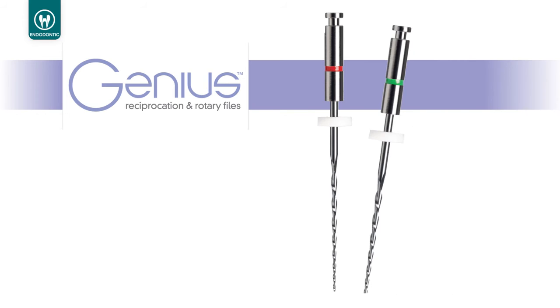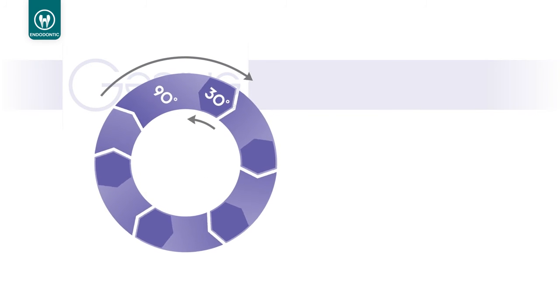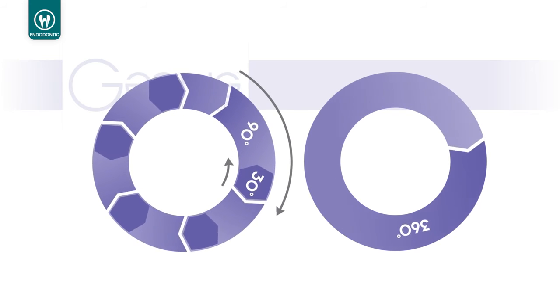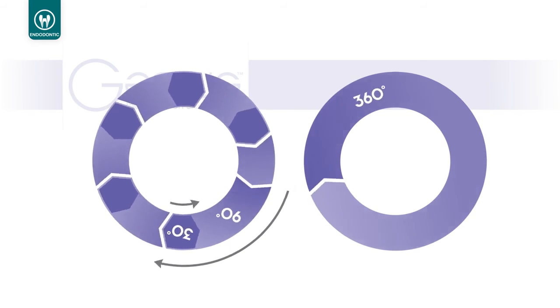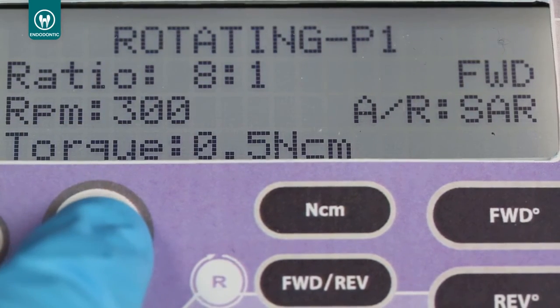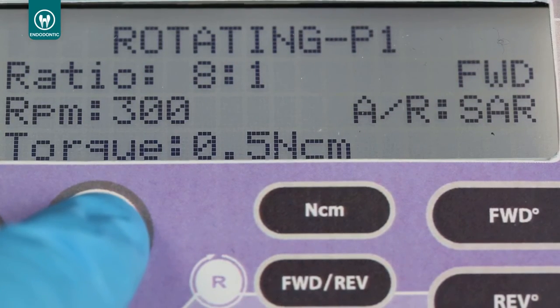So as you can see, it's easy to do all the instrumentation with 2 files after pre-flaring, and in a very safe way doing reciprocation first and efficiently removing debris in rotation. And the big thing, the beauty of this system, is the fact that you don't need to go from a reciprocation file to a rotary file. You can use the very same file to do everything.